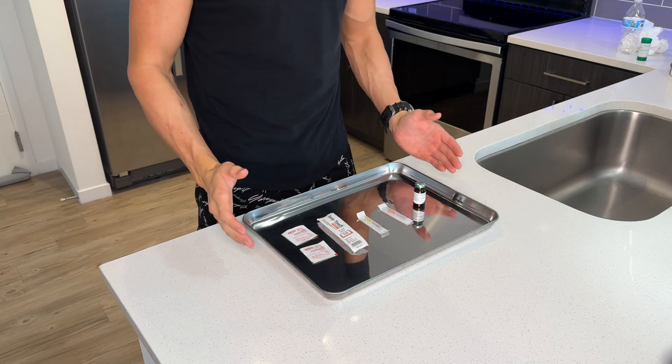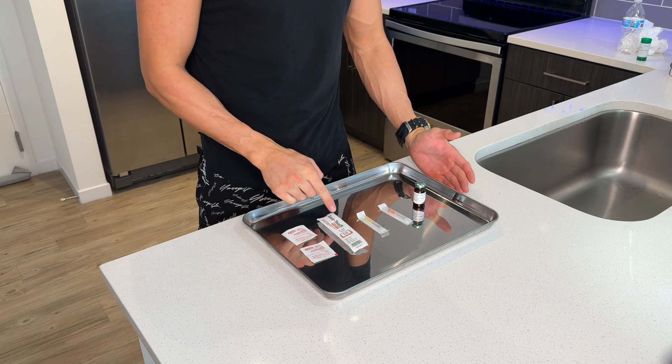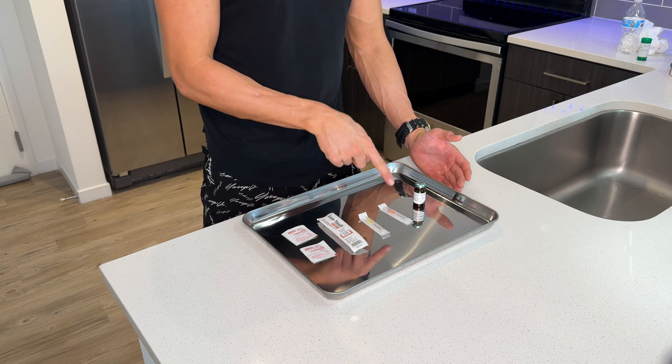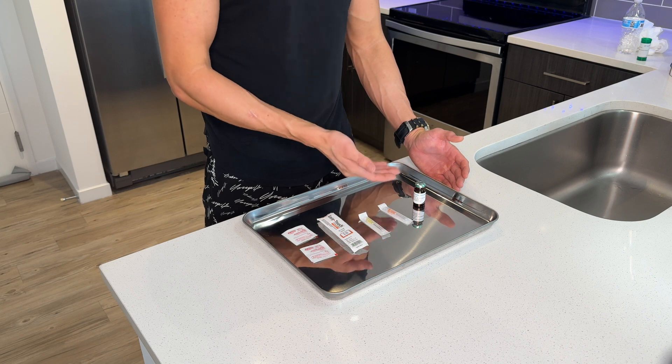Step number one is to make sure all your supplies are laid out on a sterile environment. As you can see here, we have our alcohol prep pads, we have our one cc syringe, we have a 20 gauge needle to draw the testosterone with, we have a 25 gauge one inch needle to inject the testosterone with, and of course we have our vial of doctor prescribed testosterone cypionate.